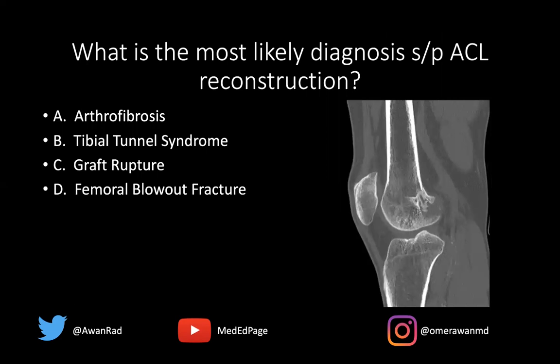Is this arthrofibrosis, tibial tunnel syndrome, graft rupture, or femoral blowout fracture? Arthrofibrosis is typically a focal form of fibrosis that occurs anterior to the graft, right in this region. It's usually an MRI diagnosis — typically dark on T1, dark on T2 — and it limits terminal extension of the knee post-ACL reconstruction. It's very hard to see on a CT exam.